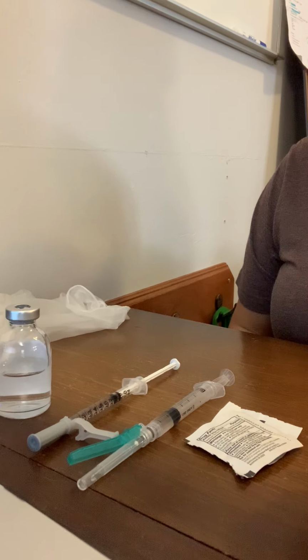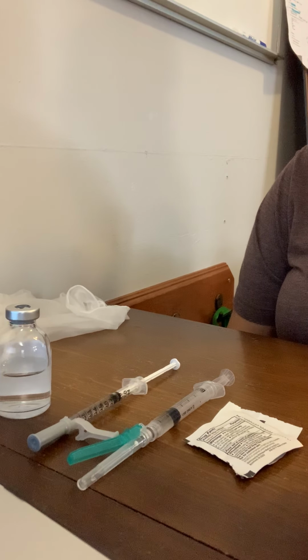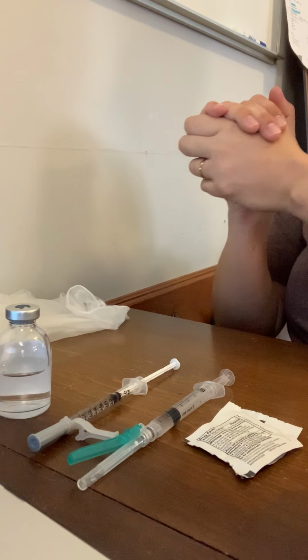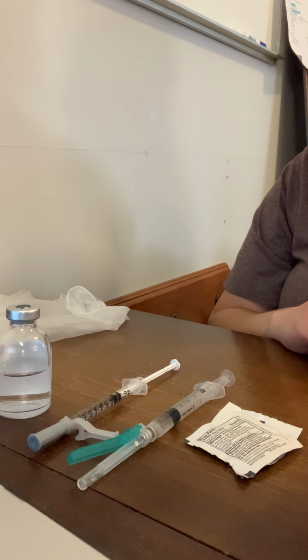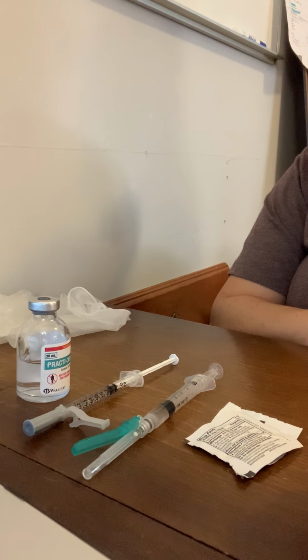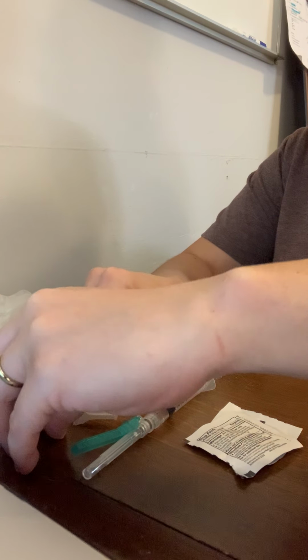I'll introduce myself. My name is Lindsay. I'm here to give you your medications that were ordered by your physician, your heparin and your Phenergan. I'm going to wash my hands and identify the client with 2 identifiers. So I've got Kelly Jackson here, date of birth 1/1/1985. At the bedside is where I'll do my 3rd check of the MAR. So I'll compare my MAR with my syringes and my vials, my 2 vials, and my physician's orders. I am going to loosen my caps.